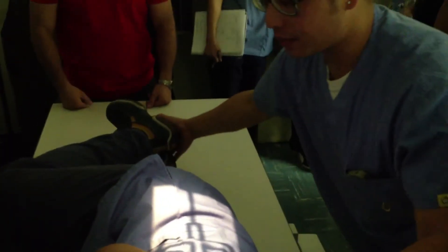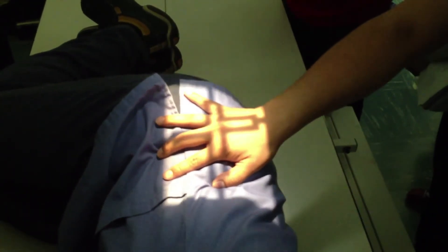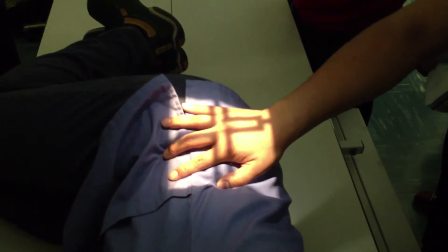You guys have questions on the lateral? Do spot, Chris. Bring this up, bring your feet up. Take a deep breath. See how the top of the crest is right here on your thumb? And your ASIS is more this way? I just bring it like this, and see where my CR is right at my knuckle? So then I just hone in on my collimation, basically like that — to my hand. And I probably get the spot pretty much all the time.